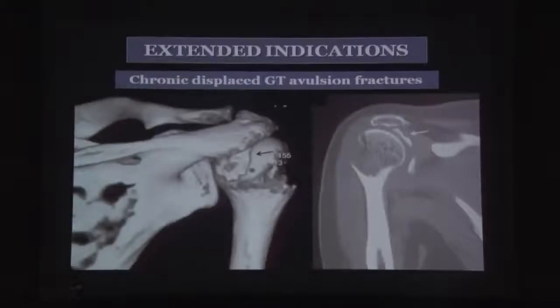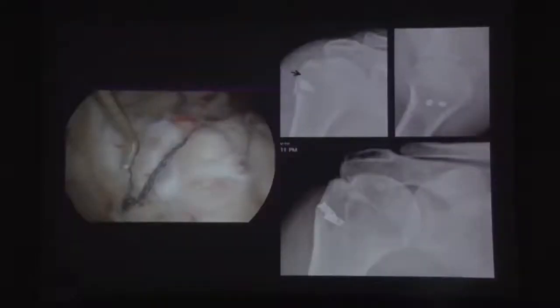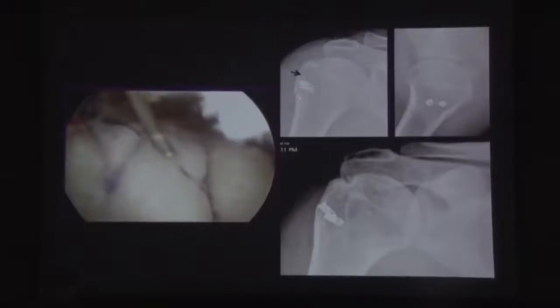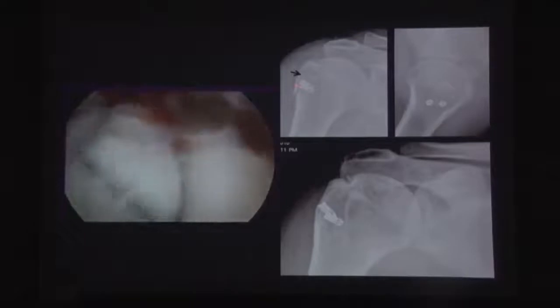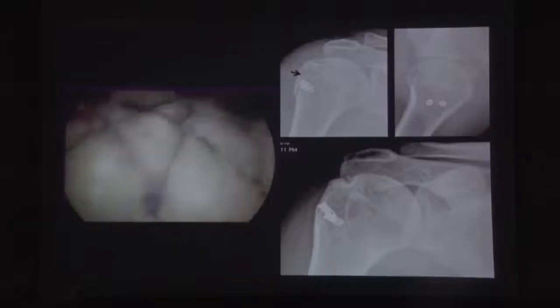Indications have been extended over the years to include chronic displaced greater tuberosity avulsion fractures that are adherent, since excellent arthroscopic release can be performed before bringing them down and fixing them. Large moderately displaced greater tuberosity avulsion fractures can also be done arthroscopically — the only difference is the distal anchor cannot go beyond the fracture site, so anchors are placed on either side of the fracture site, still achieving good reduction as confirmed on union imaging.